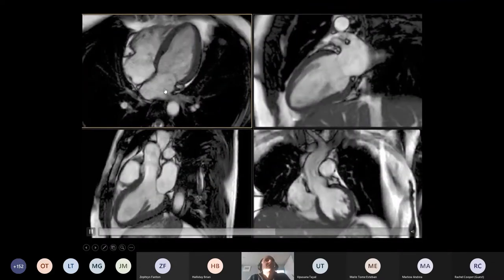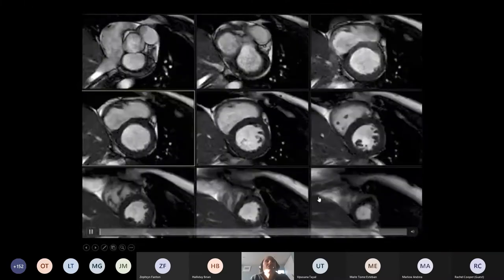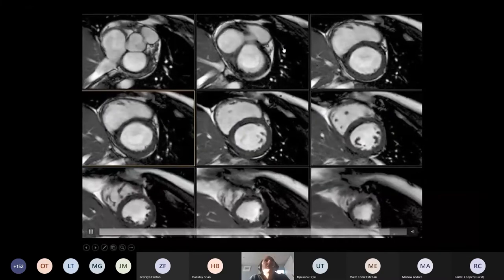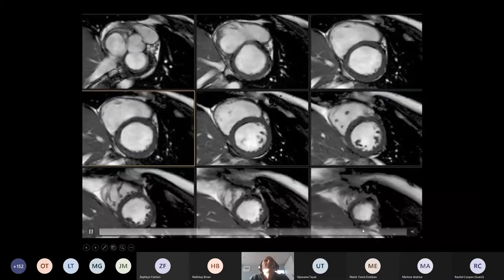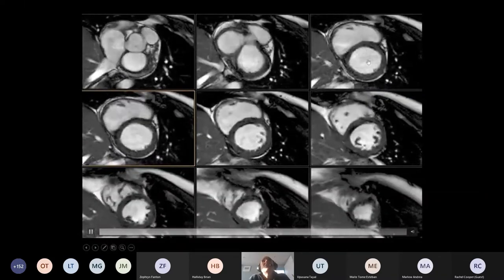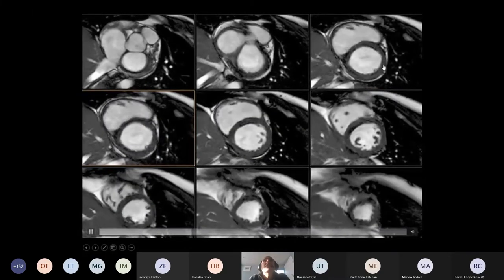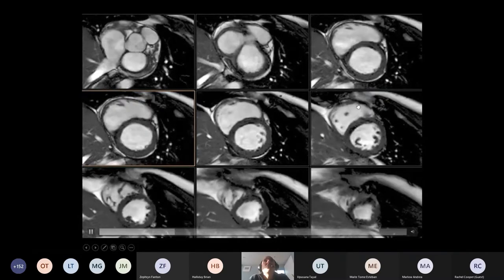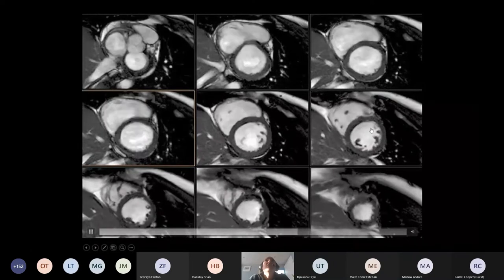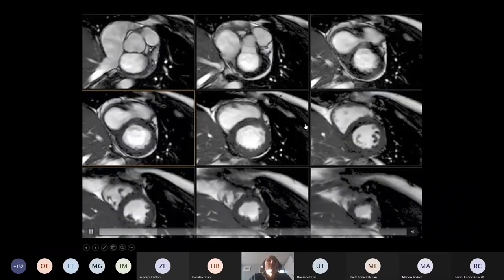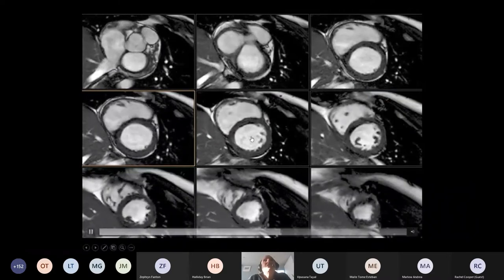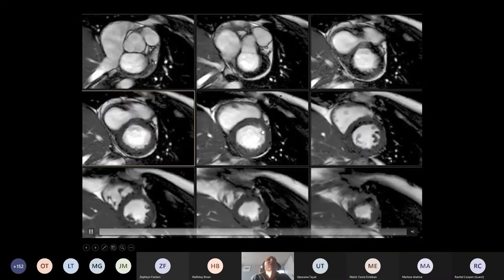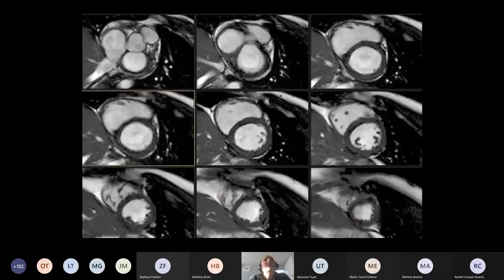Here we have our cine imaging — this is akin to what you were seeing on echo. On echo you typically take three slices through; with MRI you get lots of slices. The bright stuff is the blood pool, the darker stuff around here is the left ventricular myocardium contracting, and this is the right ventricle — the wall of the right ventricle is much thinner than the left ventricle. The stuff in here is the papillary muscles. When doing ejection fraction, you draw circles around this in diastole and in systole, and the computer works out the ejection fraction based on the difference between the two.